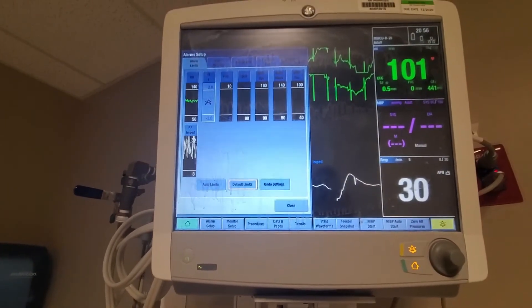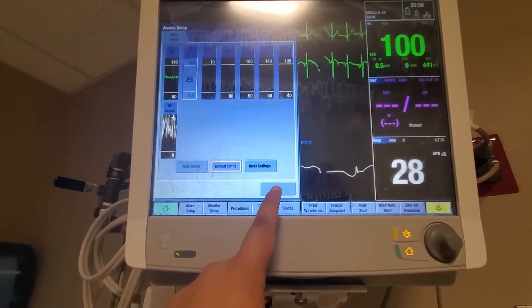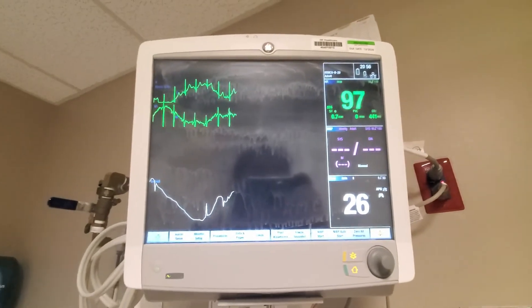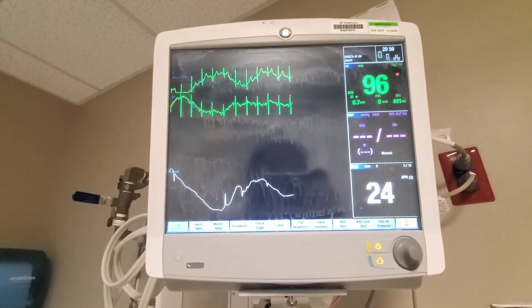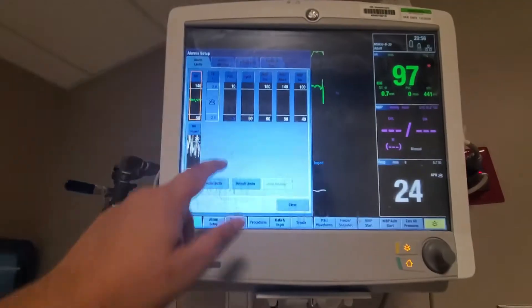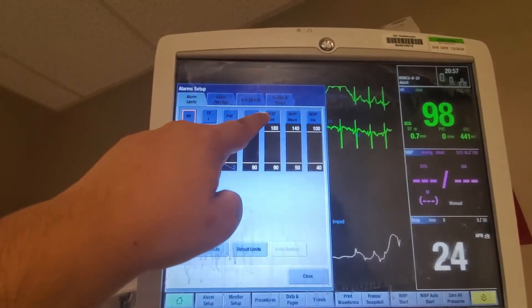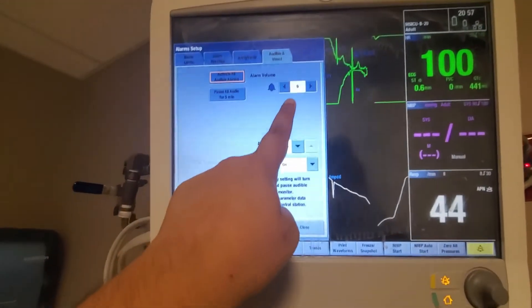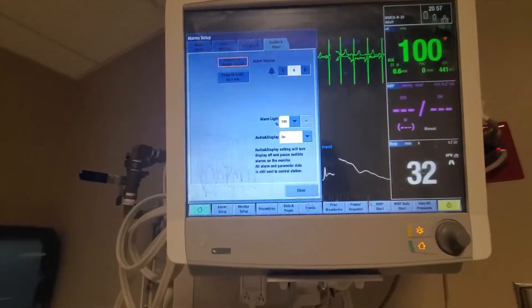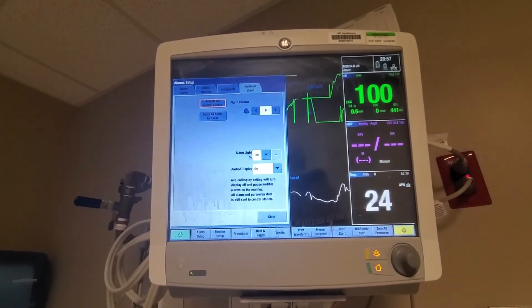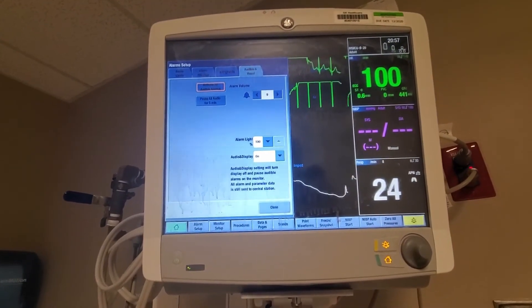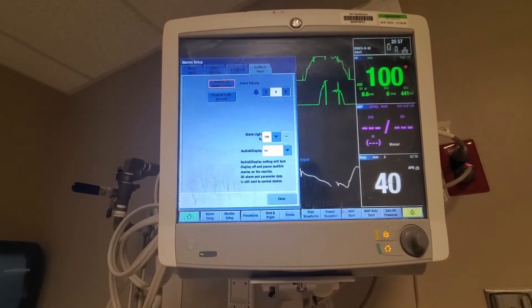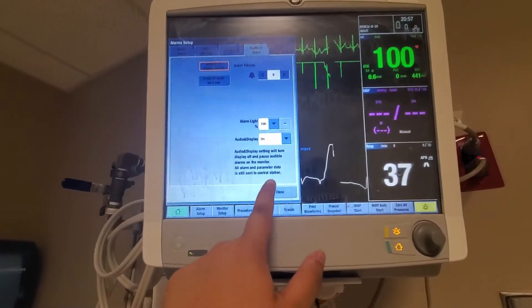Pressing default limits will change all alarms back to the preset standards. This same process happens automatically anytime you discharge a patient — it will go back to default alarms. Also in alarm setup, make sure your audible and visual volume is set at nine. This should be the default setting and will reset whenever a patient is discharged.